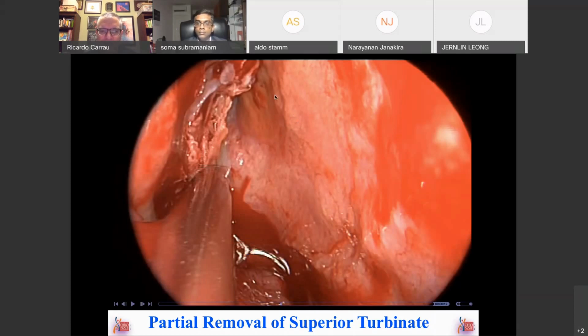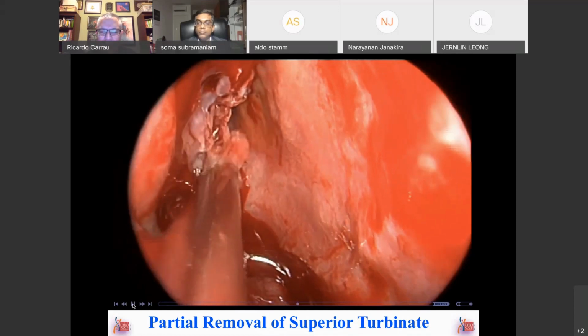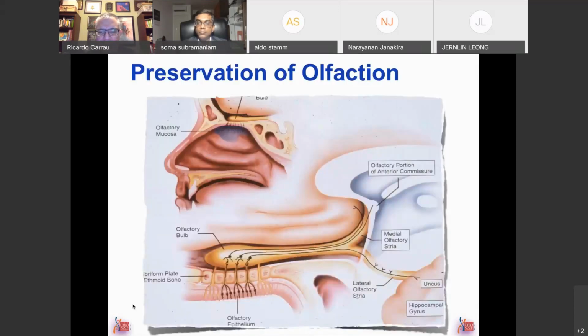Usually, this has some axial vascular supply, and this is more reticular vascular supply. So if we make incisions in the septum, I'm going to try to make them below the olfactory epithelium. So now we have created more space in this particular case. Olfaction, again, think of it.